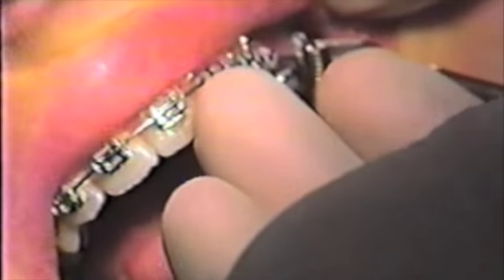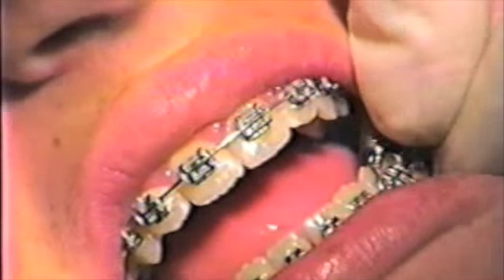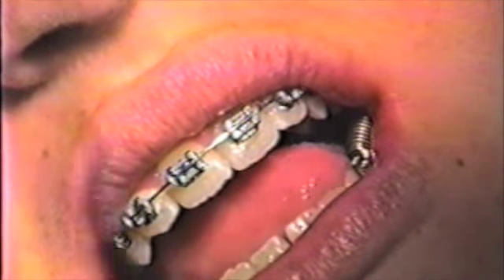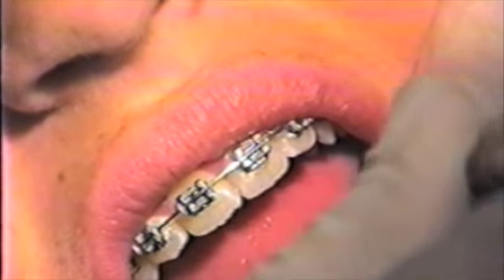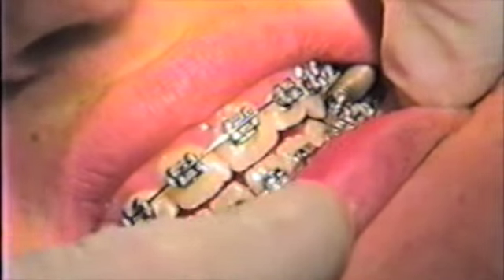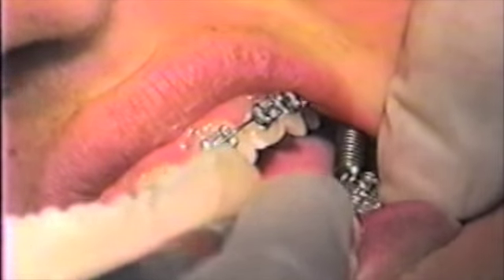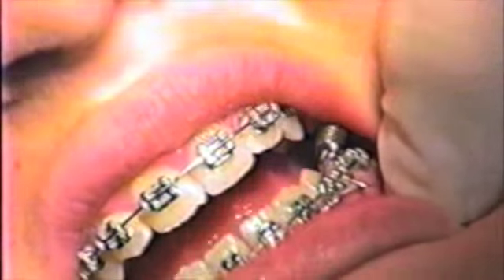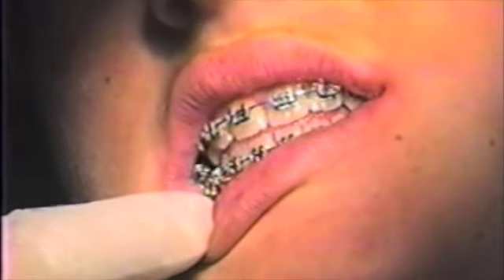Again, use a band pusher to secure the spring around the molar tube and check the occlusion. In this case, she was binding on the attachment. You can see how with lateral excursions there would be frequent bracket debonding during the month that the safe springs are in place.